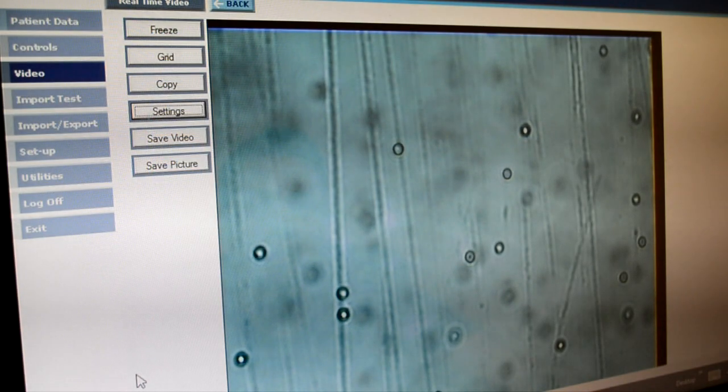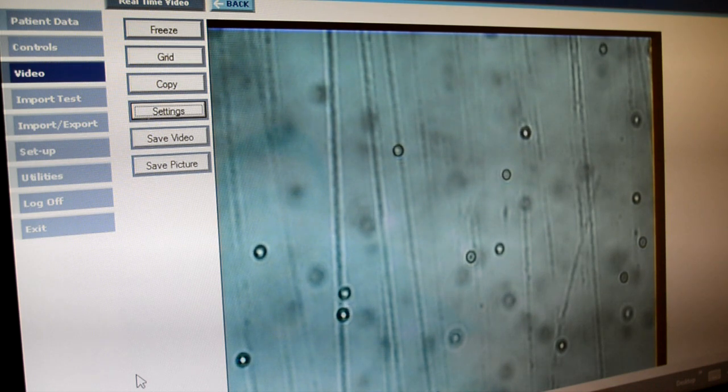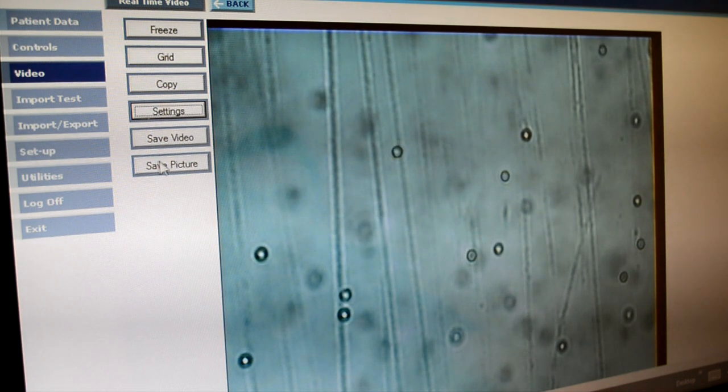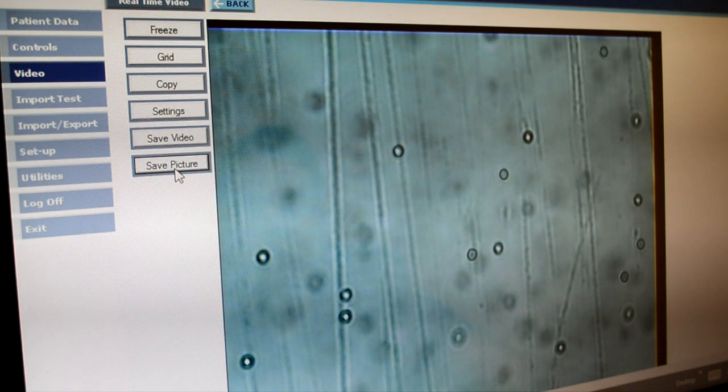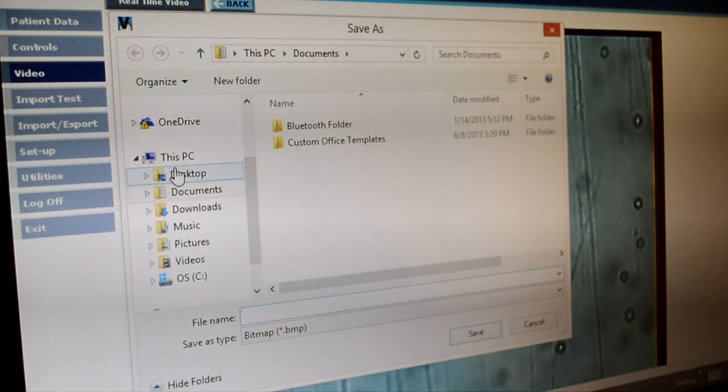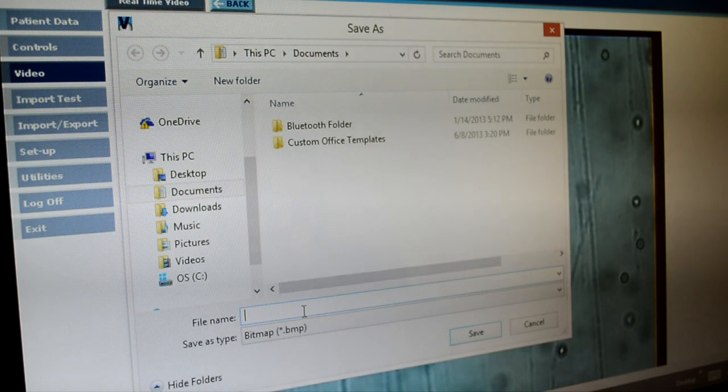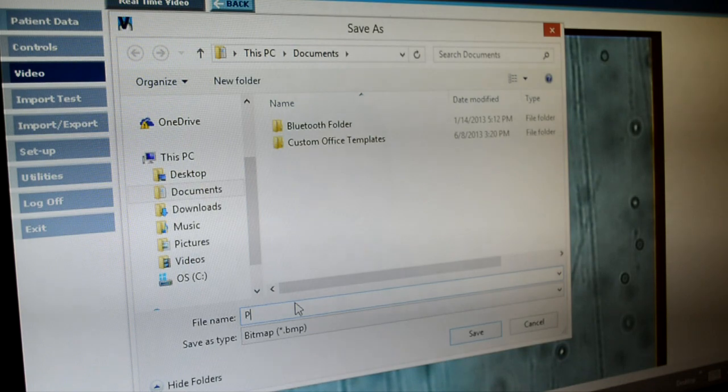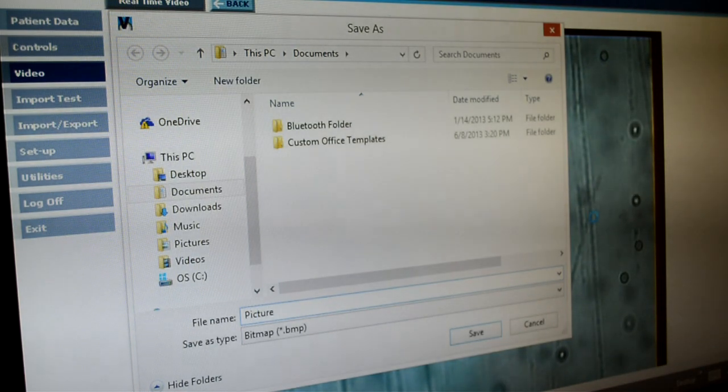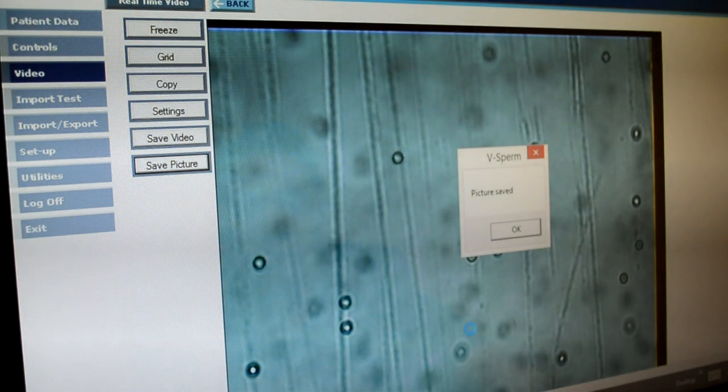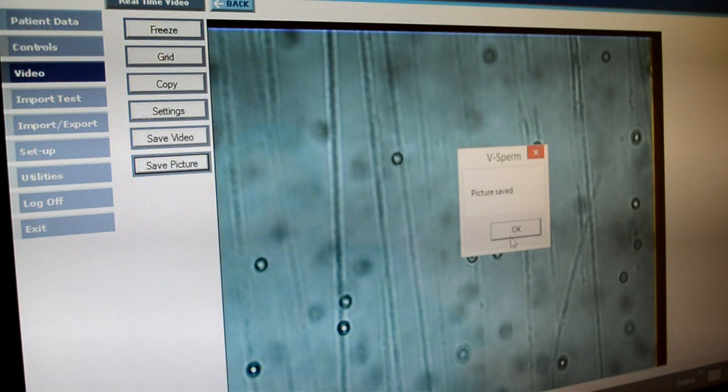To capture an image of your sample, select save picture, the bottom option. The system will now ask you to choose a file name and click save. The system will confirm that the image has been saved.